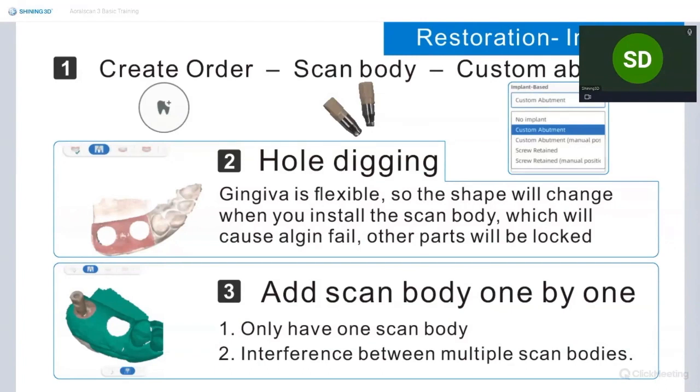Our scanners came without sound, so I will check with your scanner later. I think this sound should be turned on automatically.